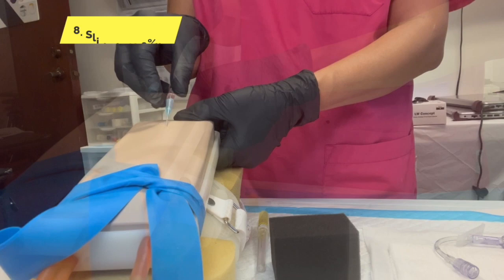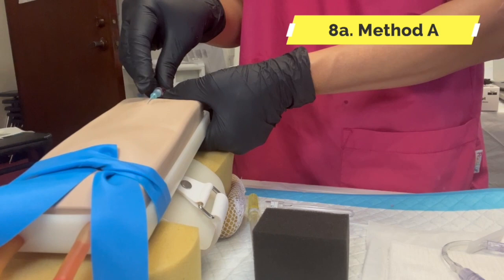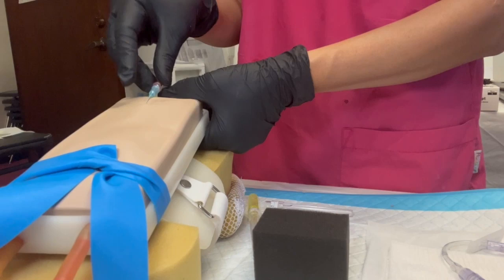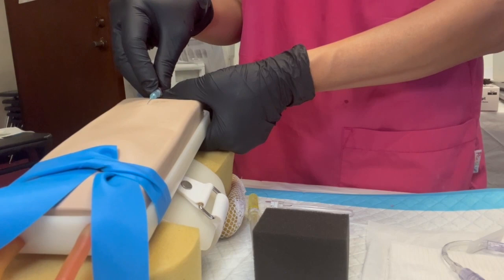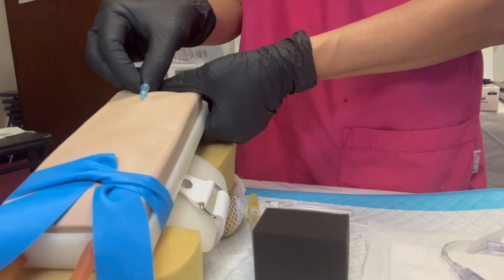Method A — what is method A? One hand. I do not leave the traction; I hold on to the clear. The clear does not move forward or backward — it stays there. Only the blue moves forward. How do you move it forward? With your index finger, one hand. If you're having problems, you can use two fingers. I should see the steel needle neck — you guys see that?